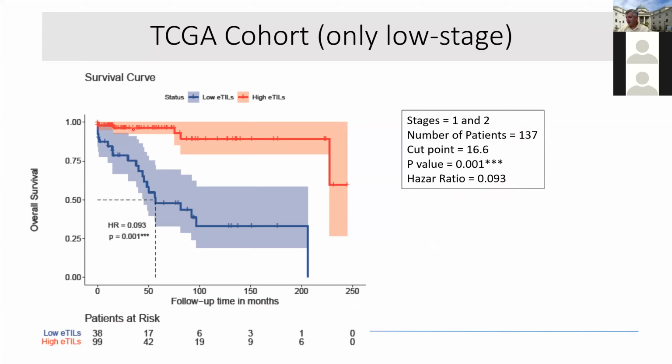And you can imagine these maybe being cases that should forego immunotherapy in the adjuvant setting anyway, because they do pretty well. Whereas these cases, if you're in this group, in the adjuvant setting, you need immunotherapy.